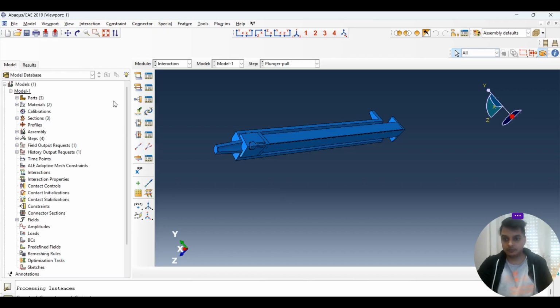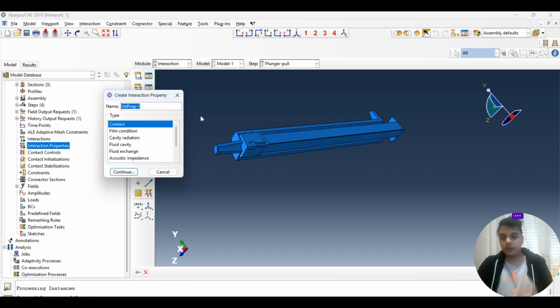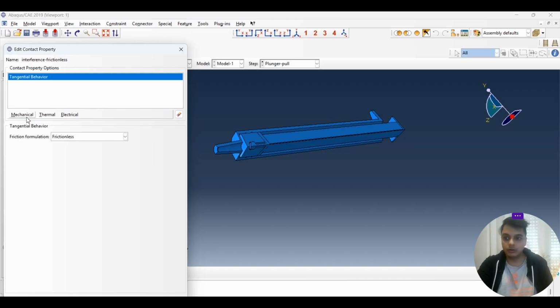We simply go to the interaction. We have interaction properties in this particular module, or you can just define it from here, all the properties. Here you can just directly see the interaction properties. So initially you want the interference frictionless. I want this to be defined, and this is a module where we define the behavior, so tangential is frictionless, it's all good enough.